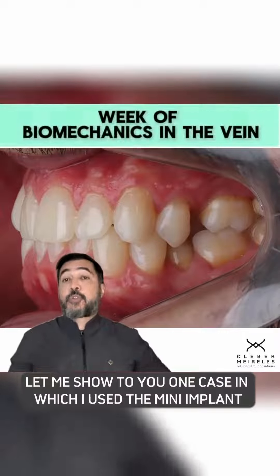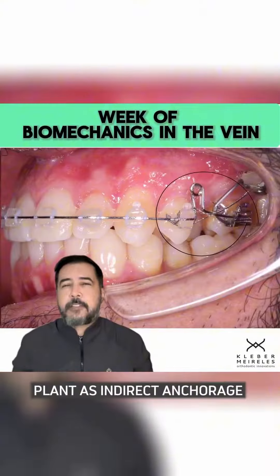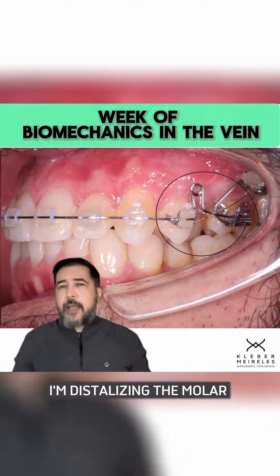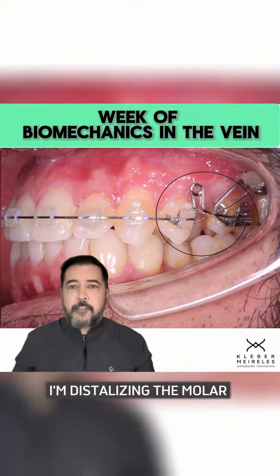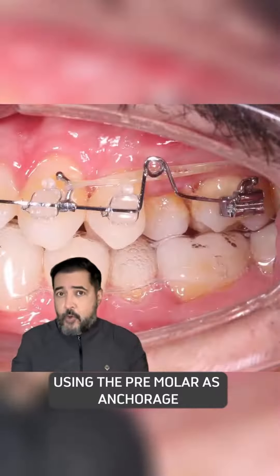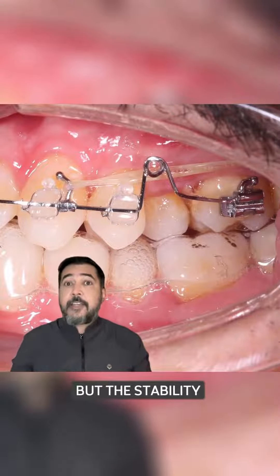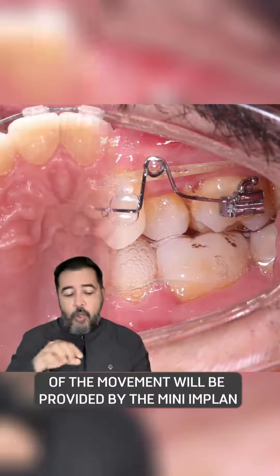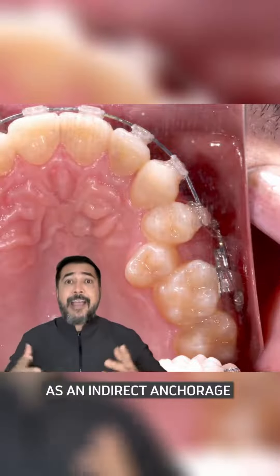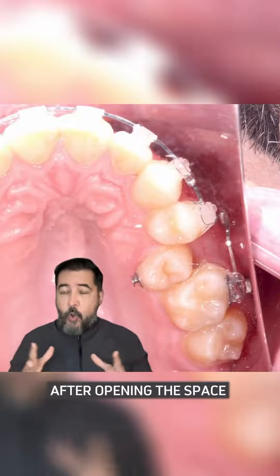Let me show you a case in which I used the mini implant as indirect anchorage. At this point I'm distalizing the molar using the premolar as anchorage with a loop, but the stability of the movement will be provided by the mini implant as an indirect anchorage after opening the space.